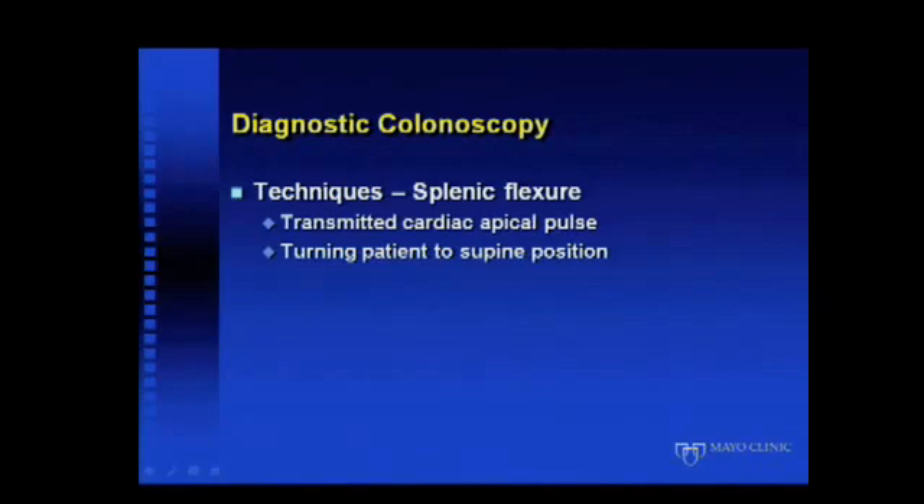At the splenic flexure, sometimes it can be difficult to determine if one is there in a patient with a very tortuous sigmoid colon. At the splenic flexure, you can typically see a transmitted cardiac apical pulse. To negotiate the splenic flexure, it may be necessary to place the patient in a supine position and use abdominal pressure. Having traversed the splenic flexure and now being in the distal transverse colon, it's then possible to hook the tip of the colonoscope and pull back to take out any excess shaft creating a sigmoid loop.